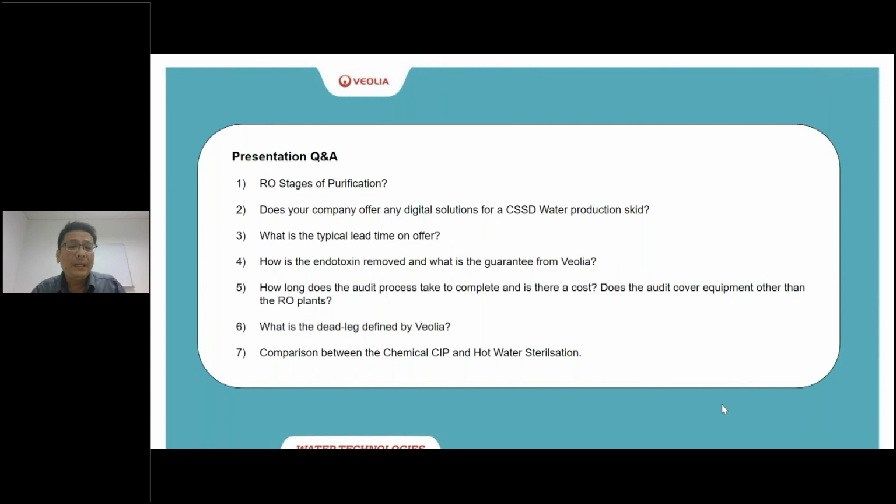To me, CIP is considered a not so easy approach that tends to be done infrequently because of its difficulty, maybe its toxicity, or the longer durations compared to hot water or heat sterilizations. Not only longer, but it also takes longer time for rinsing out the toxic residue and its verification process itself.